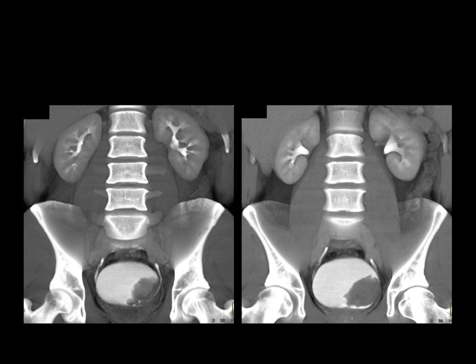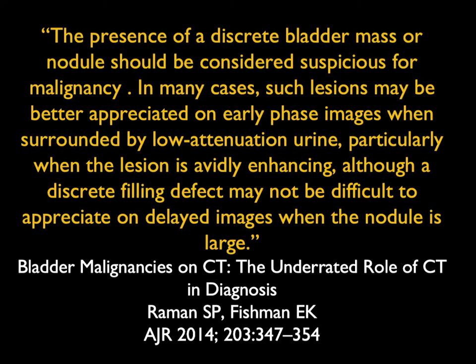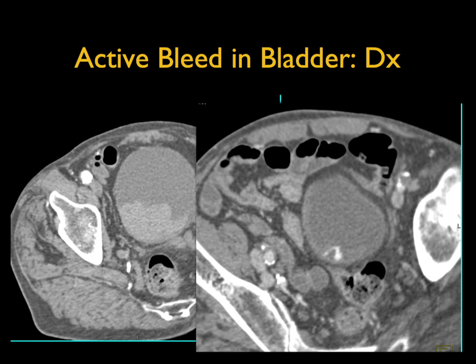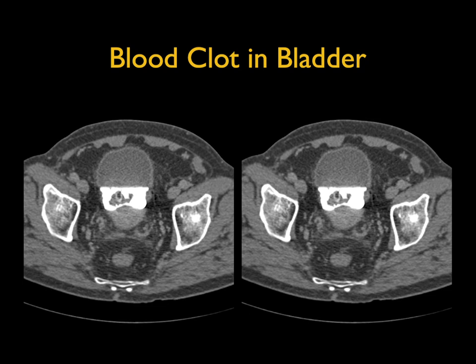Sometimes things are obvious on the excretory phase, sometimes more obvious early. Smaller tumors may only be seen on the arterial phase because on the venous phase you get partial volume averaging and don't really see them, and contrast in the bladder will cover things up. A discrete bladder mass or nodule should be considered suspicious for malignancy. You also need to look at the bladder for high-density hematuria — when you look more carefully, you can see a jet of active bleeding, and on the delayed phase you see blood clots layering in the bladder.